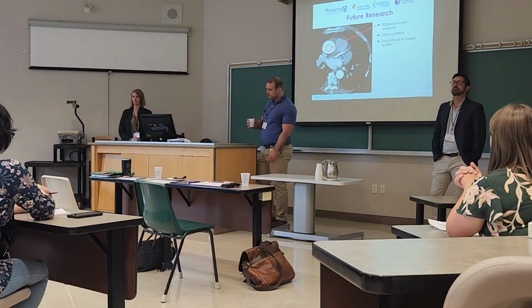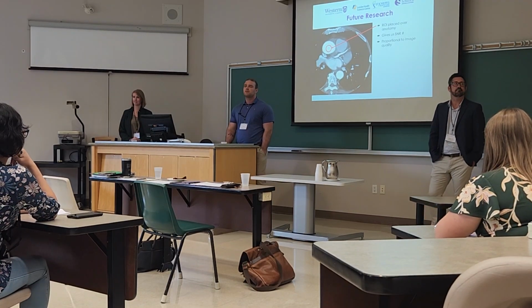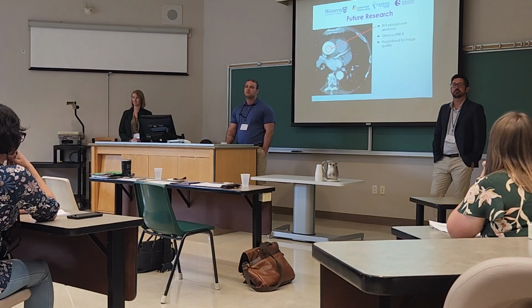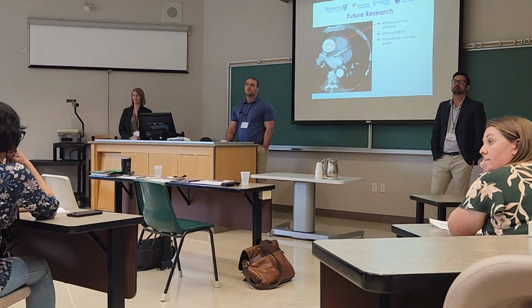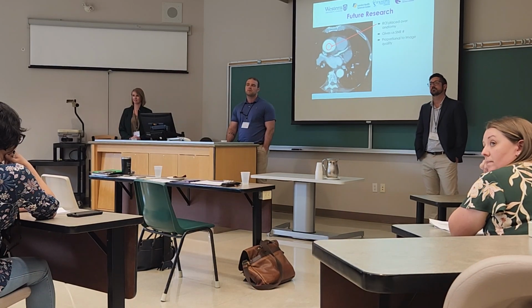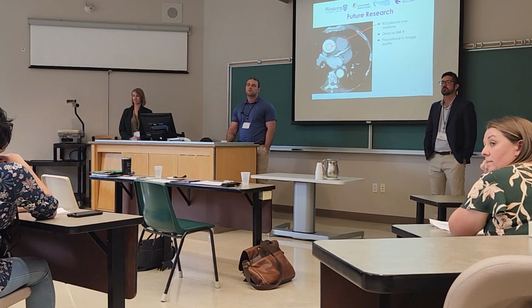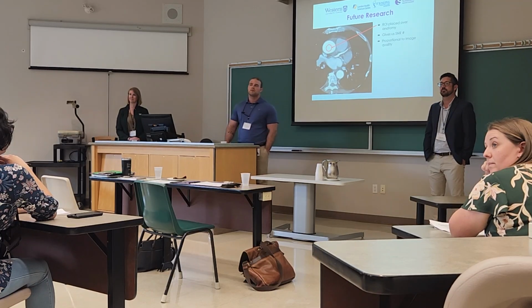And this is thematically what a whole lot of the vendors are doing. What that lets us do is actually undersample the data compared to what we would have done conventionally in CT for a long time. This is happening not just in CT, it's happening in a lot of other modalities. So yes, it's actually on the acquisition side. Jason's right, part of this will be the style of scan that we're doing, but a lot of it is just that the photon flux is way lower than what we would have done before because we can deal with that on the software side.